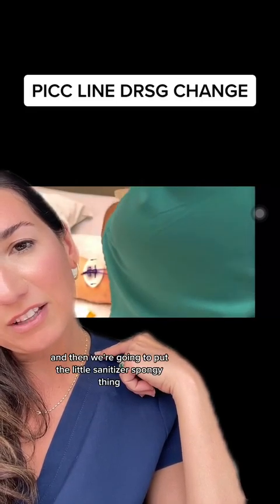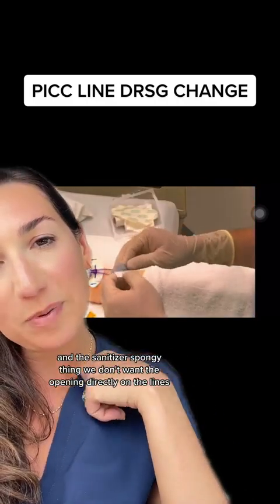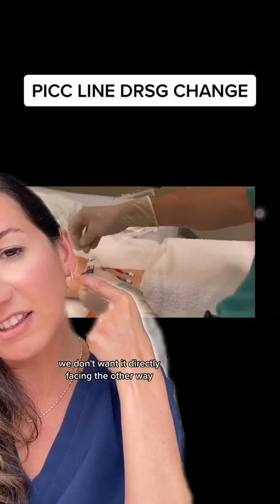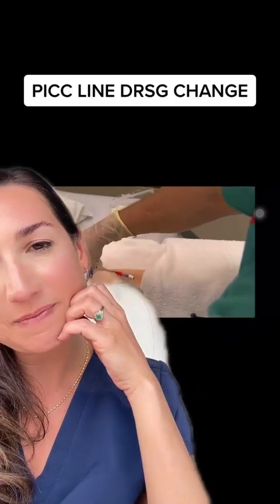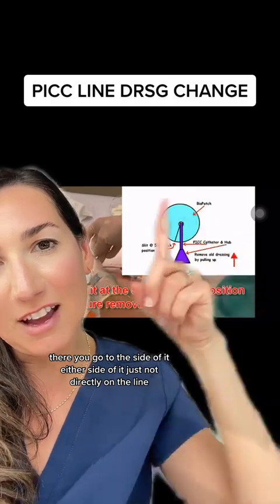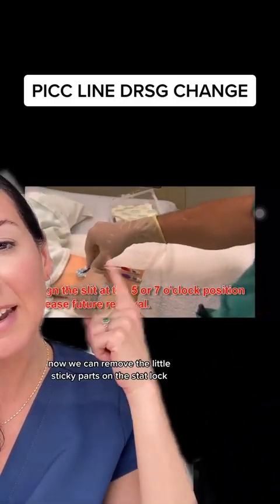Next, place the sanitizer sponge. You don't want the opening directly on the lines, and you don't want it facing directly the other way either. They like to say position it at five and seven o'clock — so place it to the side, either side of the line, just not directly on it.